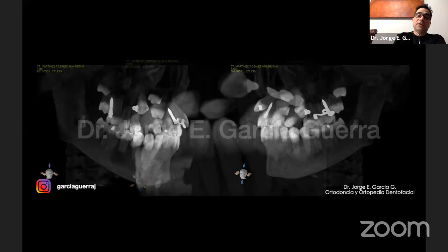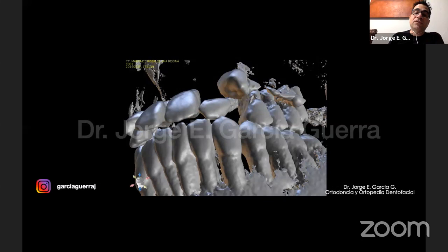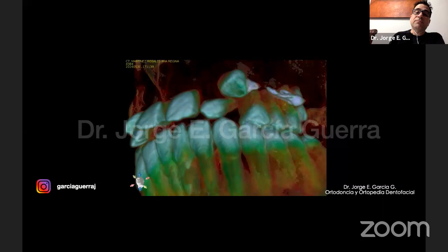And this is the one on the left side. You can see how it moved the lateral incisor. So we're going to have to do a lot of work there with our ortho treatment. You can see how the roots are inverted there, but our canine was in the mouth. That was the important thing. You can see the canine there.